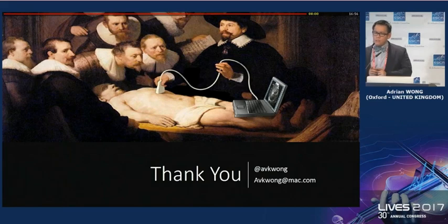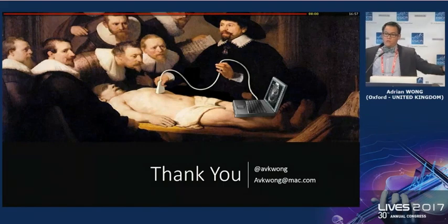It's to do with image quality, I think. I've tried those portable ones. I think the portable ones are useful because they're portable. So if you're running to a ward, you can bring it with you. The image quality isn't as good as a dedicated point-of-care ultrasound machine, but it allows you to make the call: is this heart, for example, terrible, or is this okay? But if it's differentiating a 45% ejection fraction versus a 55% ejection fraction, I don't think it will do that. But it will tell you the former.